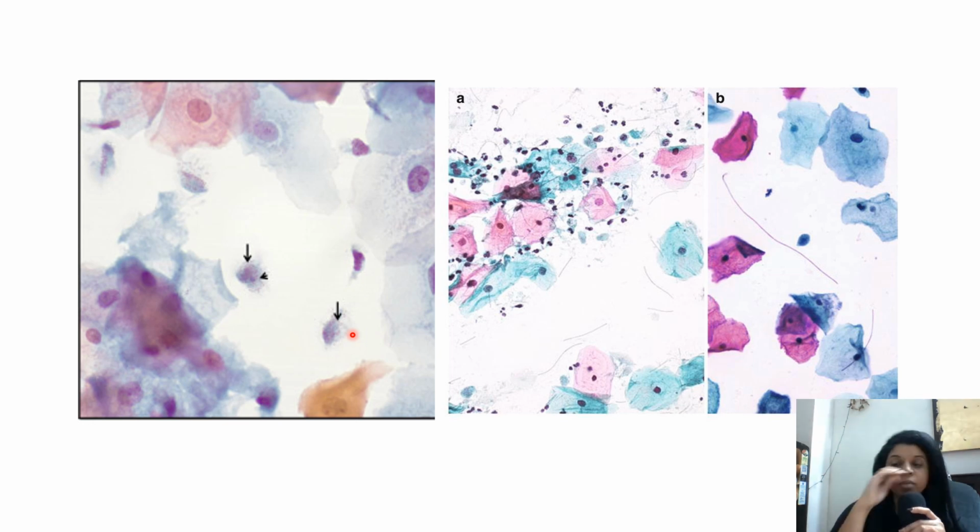Maybe the patient will come with greenish discharge, but not all gynecologists might write strawberry cervix. They might write something like inflamed cervix. So even if you see any vaginal discharge, you still have to look for Trichomonas in the slide. You can see pear-shaped organisms, and along with Trichomonas, 80 to 90 percent are associated with Leptothrix according to the studies.